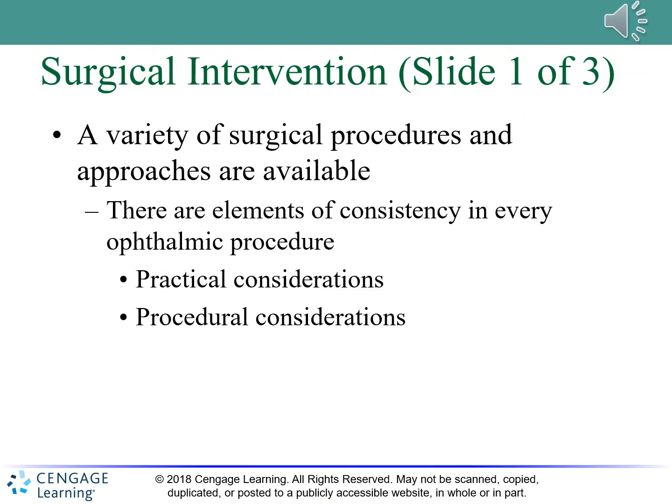Okay, so under surgical intervention, the practical considerations, the second bullet you need to know: non-powdered gloves should be used. If not available, the powder should be thoroughly removed from the gloves. A lot of times you'll see your ophthalmic surgeons coming in and you'll have a basin of water and they will rinse off their gloves after you've gowned and gloved them. They will wash their gloves off in that basin, and then you'll hand them a towel to dry, and then they're going to proceed with the procedure.